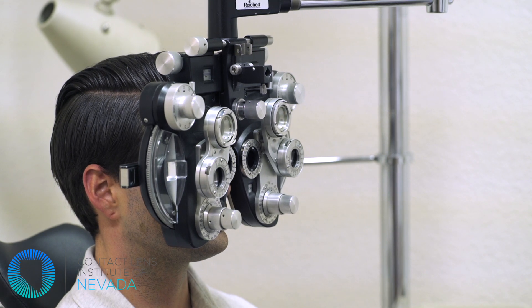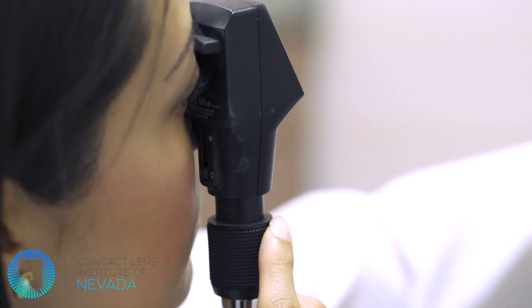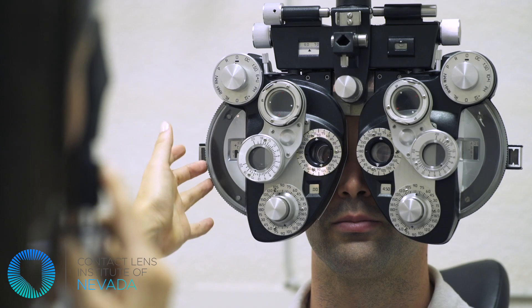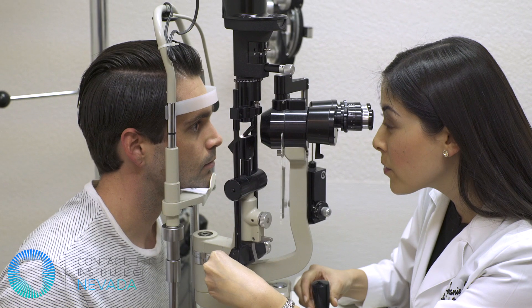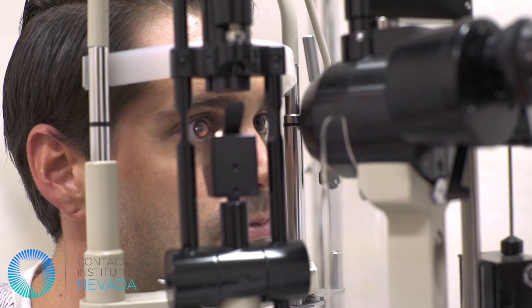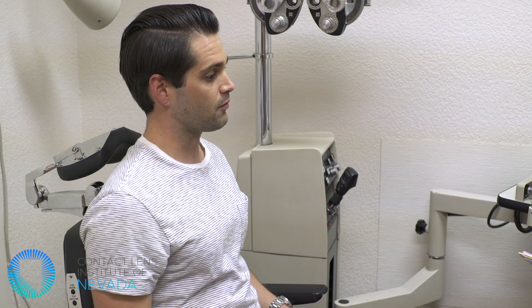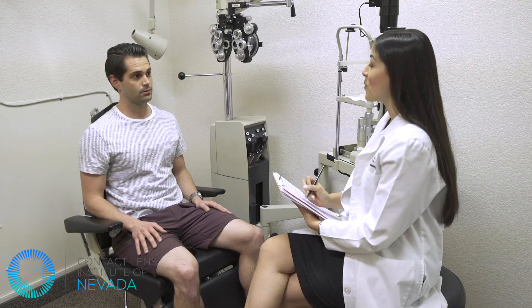After that, if the lens is being used to correct your vision, they will then check to see what power needs to be added to the lens. The practitioner may also check the lens fit one more time to see if there are any small adjustments that need to be made before removing the lens. After the diagnostic fitting is complete, your practitioner will contact the laboratory and order your lens. Scleral lenses are extremely custom to each patient, so fabrication time could be one to four weeks depending on the complexity of the lens and the laboratory.